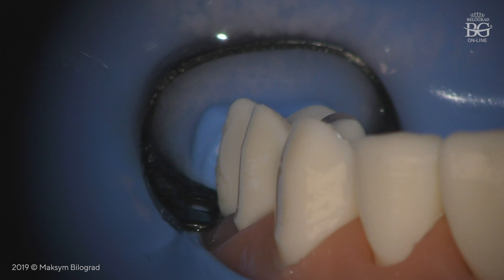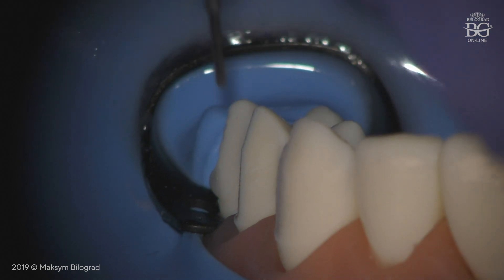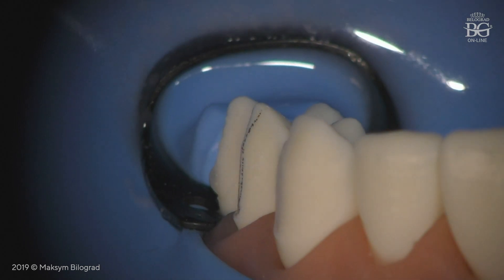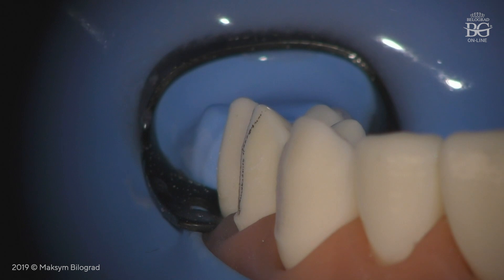Now we have finished our preparation of the middle plane and second plane. Look at what we have: we have one plane, we also have the second plane. Here you can see the finish line that was created by itself, by proper angulation of the burr and by the specific design of the burr that has a rounded tip.